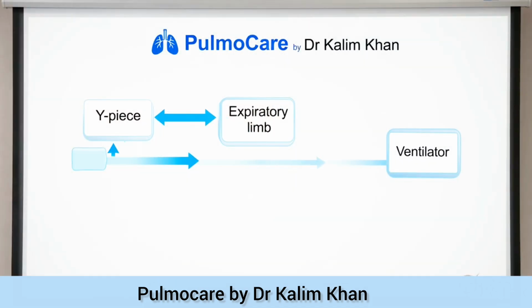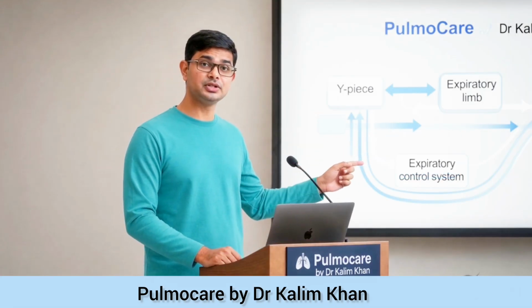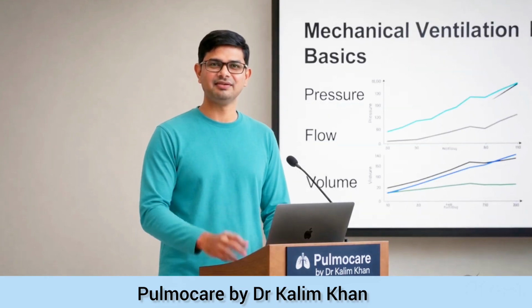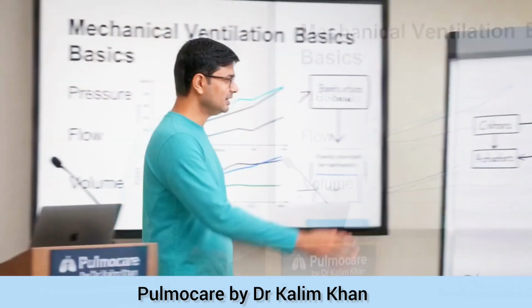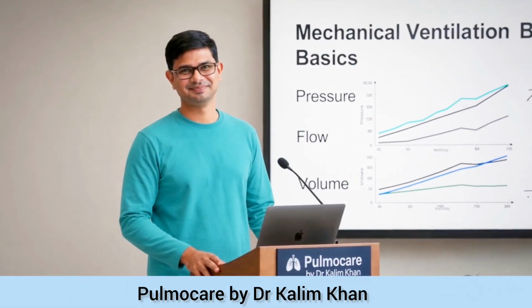During expiration, gas travels from the patient through the Y-piece and expiratory limb, passes through the expiratory control system, and returns toward the ventilator. Throughout this process, the ventilator continuously measures pressure, flow, and volume. This is the basic architecture of a modern mechanical ventilation system.